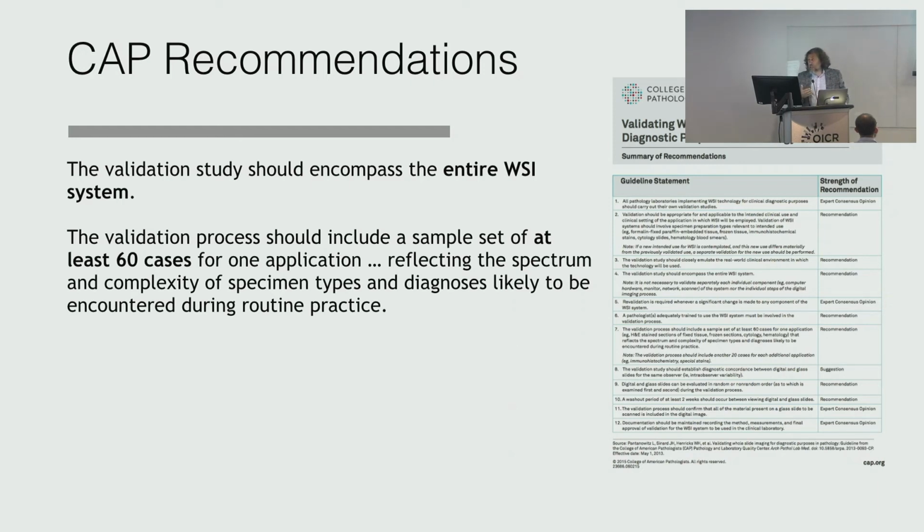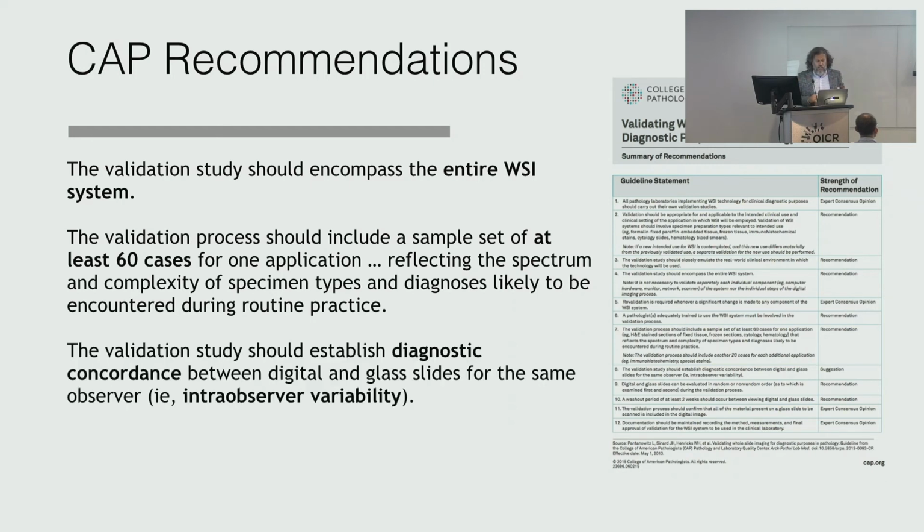The CAP is suggesting that if you want to see whether digital is the same as microscopy, you have to look at least at 60 patients. They should be representative, in terms of complexity. And you have to look at the diagnostic concordance.